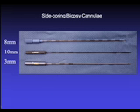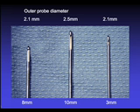This slide shows the different side coring cannulas available with 8 mm openings, 10, and 3 mm. We tend to use a 3 or 5 mm side coring cannula for deep targets such as those within the thalamus or brainstem. The outer diameters vary between 2.1 and 2.5 mm.